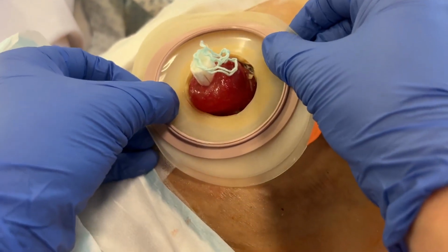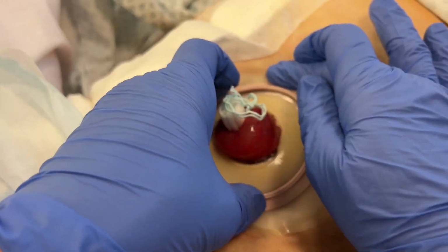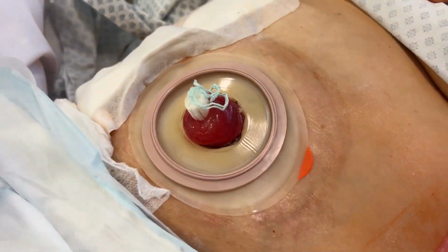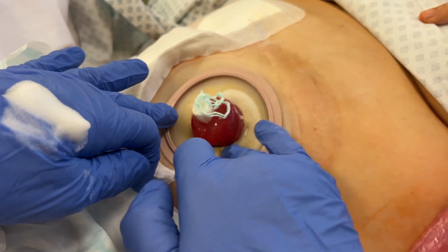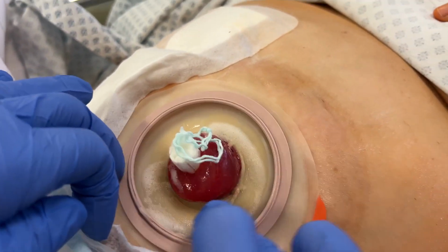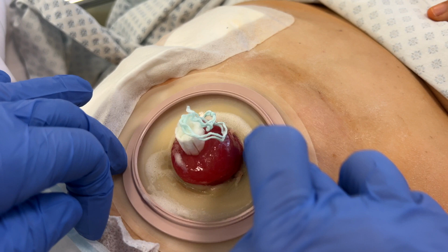After applying the base plate, it is advisable to gently press the appliance around the stoma with a moistened finger to ensure good adhesion to the skin. This is especially important for ileostomies, where the waste is aggressive. The peristomal skin must be completely covered with only the stoma visible.